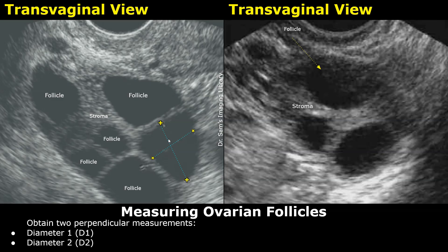Now we obtain two measurements at right angles to each other. The first measurement is diameter 1, or D1, which is the maximum diameter of the follicle. The second measurement is diameter 2, or D2, taken perpendicular to D1. These two measurements account for the fact that follicles are often oval rather than perfectly round. Both measurements must be taken on the same frozen image where the follicle appears maximal.